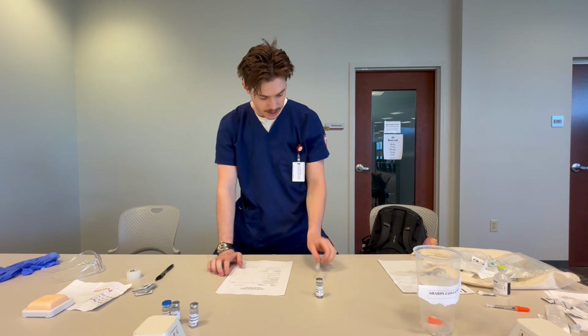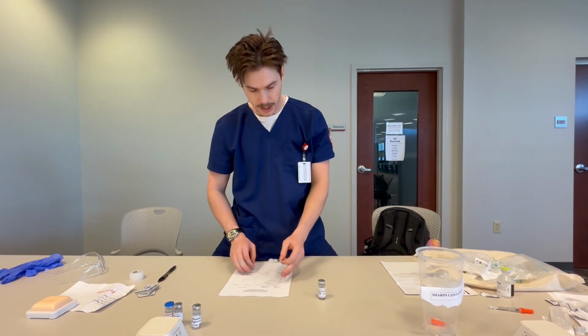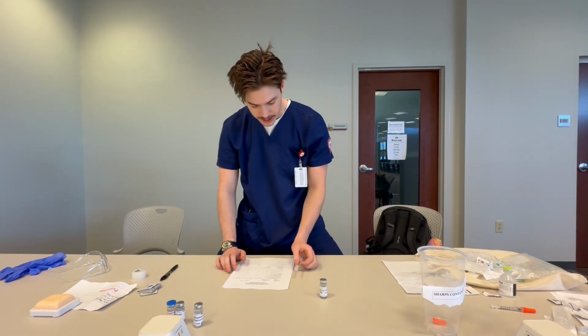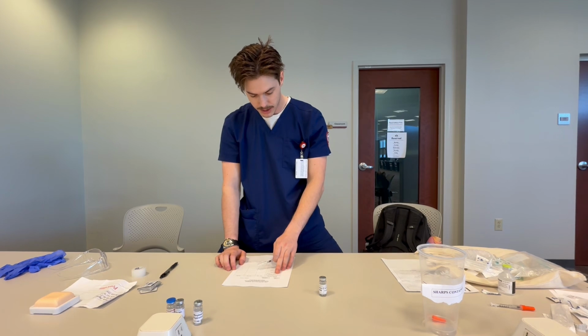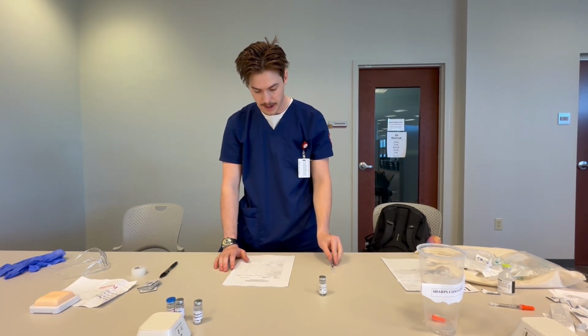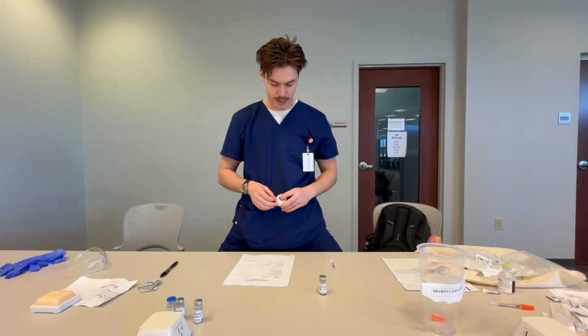I pulled out 10 units, which is what is ordered here. 10 units of Novolin R insulin. This is a subcutaneous needle, which is what is needed for this procedure, subcutaneously 30 minutes before a meal, which is the right indication.